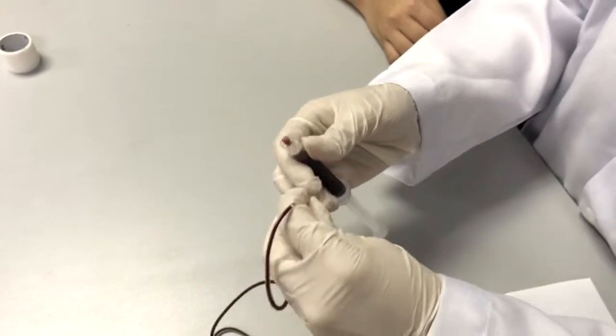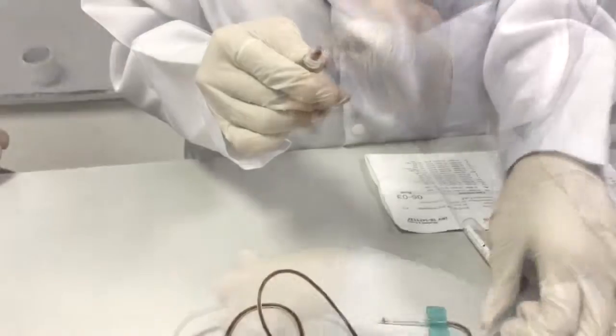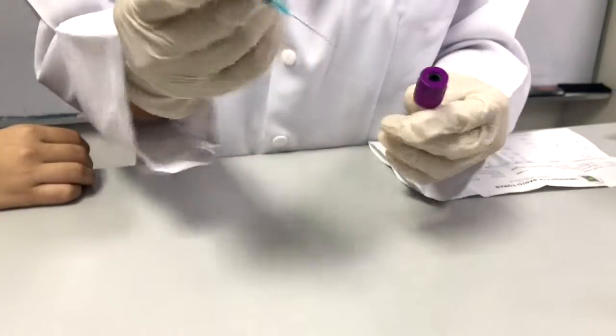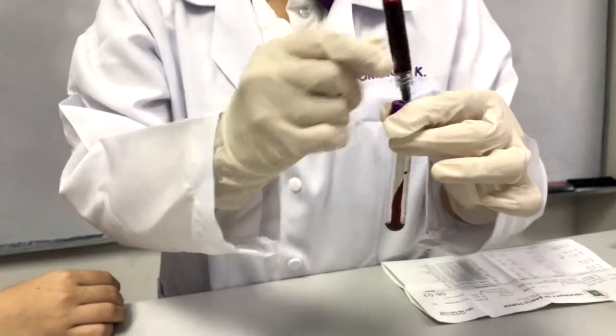Disassemble the system by removing the barrel from the tube of the butterfly needle. Close the syringe by placing back its original needle. Remove the cap and transfer the sample into the evacuated tube, and wait for the vacuum to do its job.